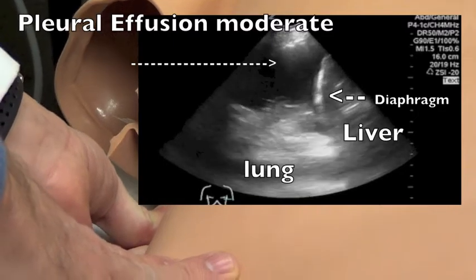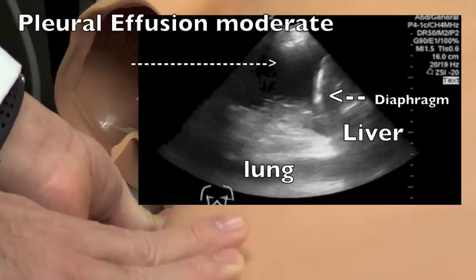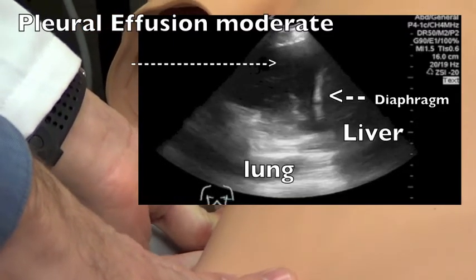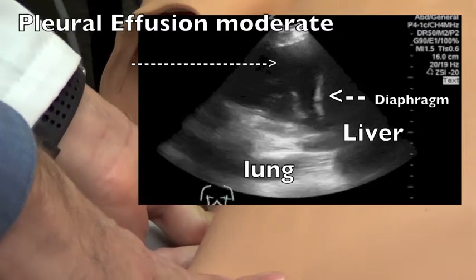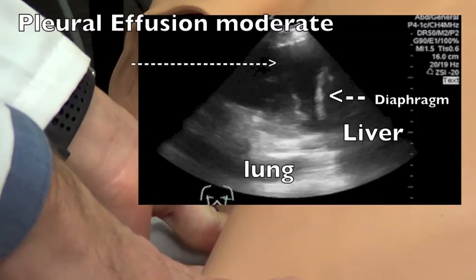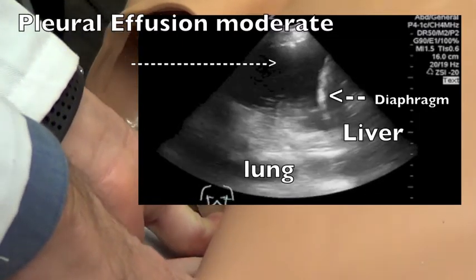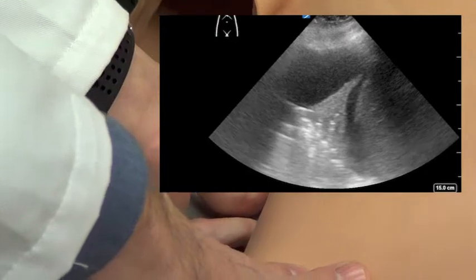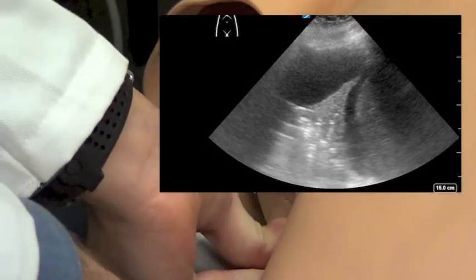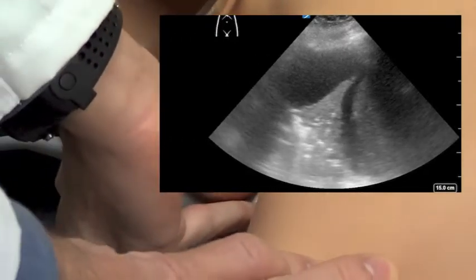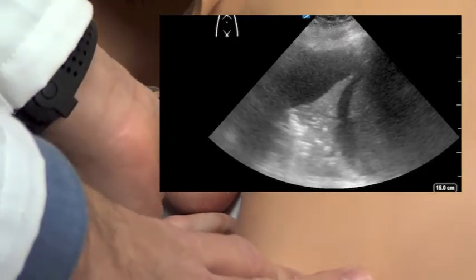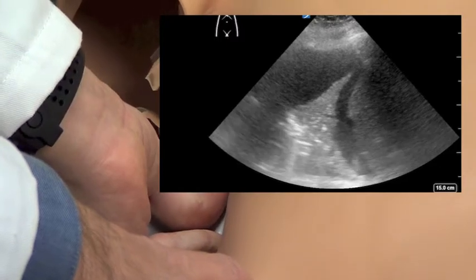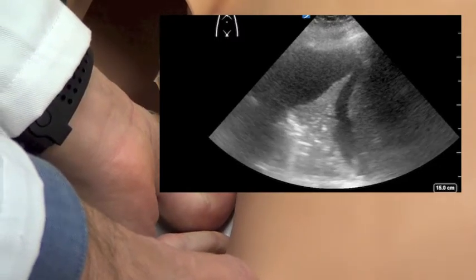I'm going to continue — I see the diaphragm. I'm going to continue in the cephalad or superior direction, keeping the probe oriented in the same axis in the mid-axillary line. And I'm going to identify my fluid pocket, which is going to be hypoechoic, as you can see on your screen.